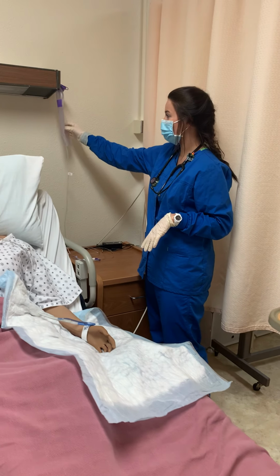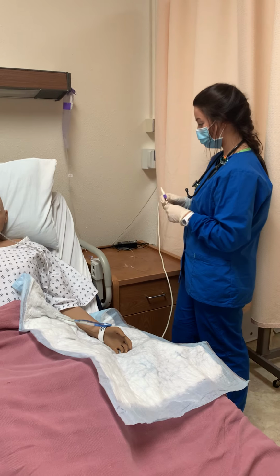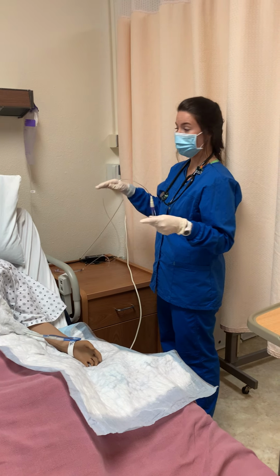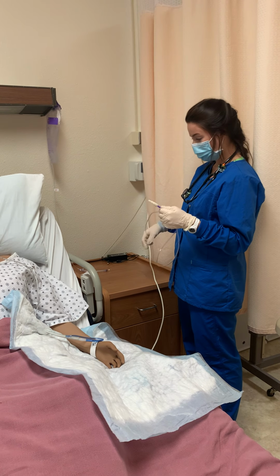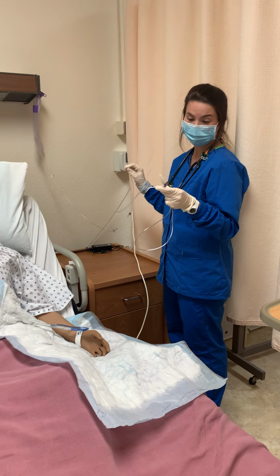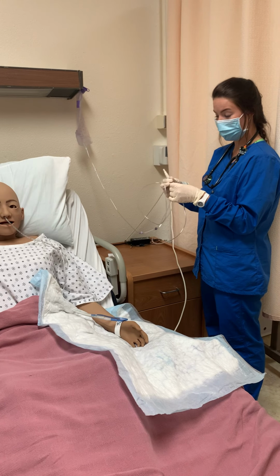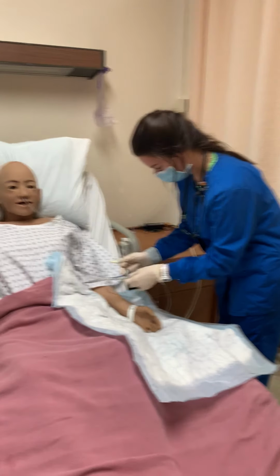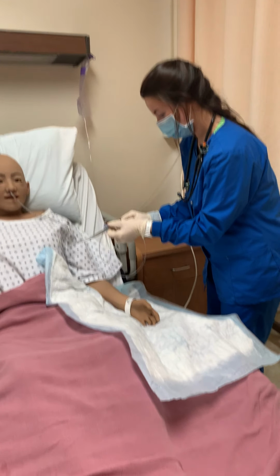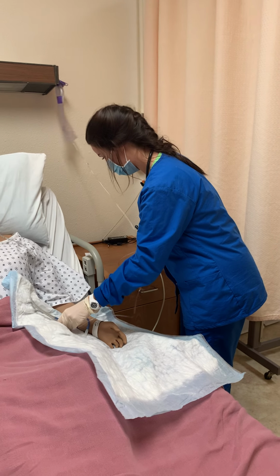Make sure I had my 40 milliliters in here, just like Dr. Jeff has prescribed. And then your tubing, it kind of hooks up like an IV would. So you'd set your tubing in, program it to your 40 milliliters an hour, and then you want to prime your tubing. So you'd hit prime, it would prime through to the end of your tubing here. And then after it has been primed, then you would be able to hook it to Joanne.